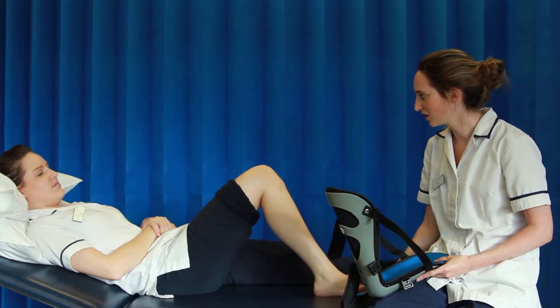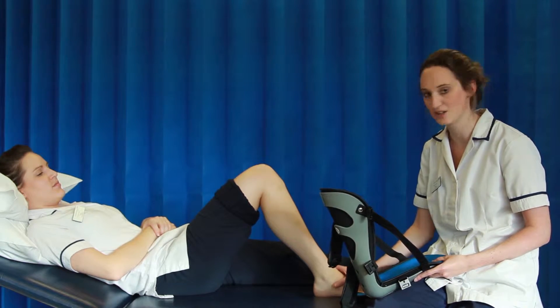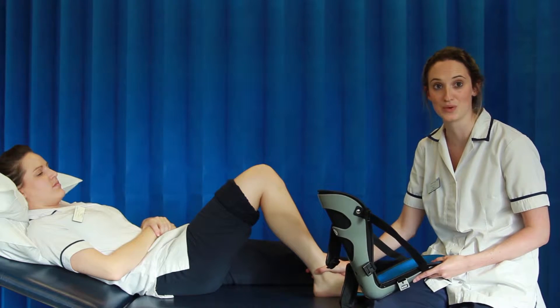You must check the skin for marking before applying the splint. If you notice any red areas or an increase in swelling, please consult your physiotherapist before applying.